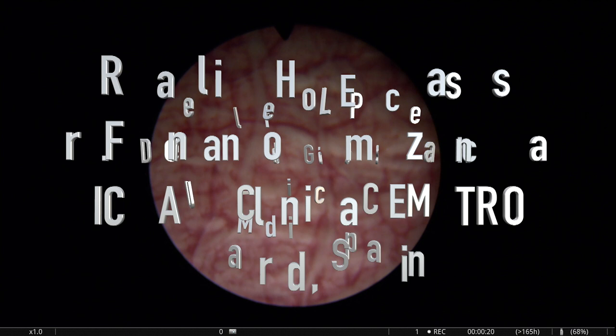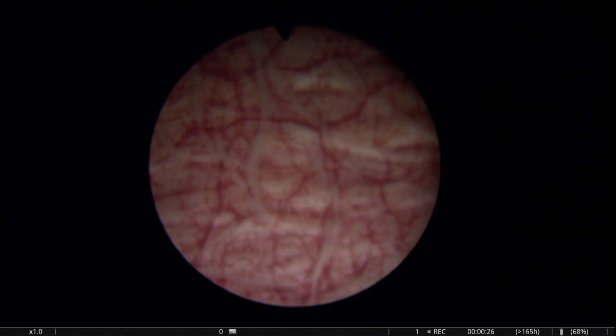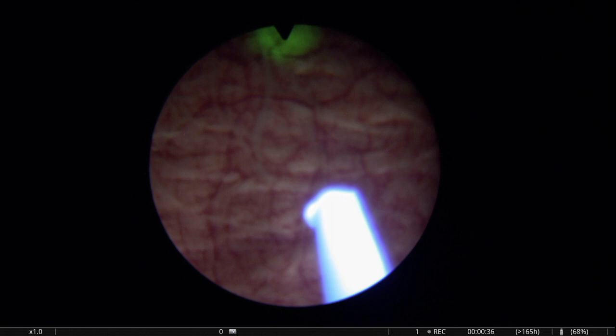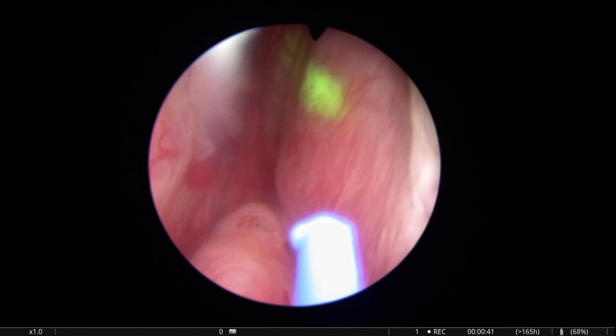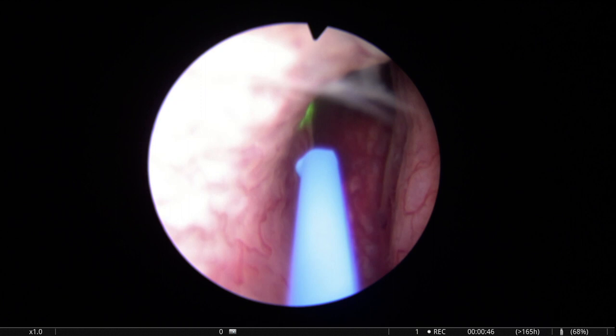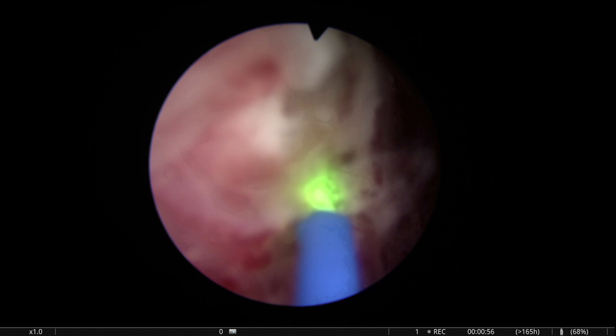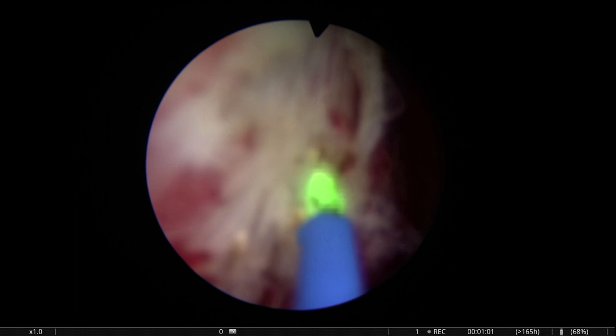One of the reasons why you have to cut the tip of the fiber with a low power laser is because these fibers do not break during the procedure. So they get cracks in the surface, they get progressively deteriorated. So you have to realize that the tissue effect is going to change if you don't cut the tip of the fiber to get a better effect.